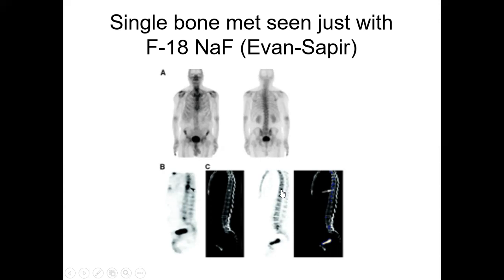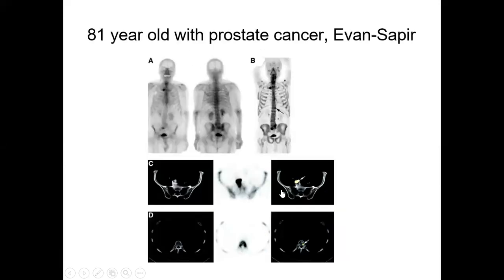The reason we don't do it is primarily cost and PET camera time. If we all had 4 or 5 PET scanners and sodium fluoride was the same price as MDP, we would probably do this as the standard technique.